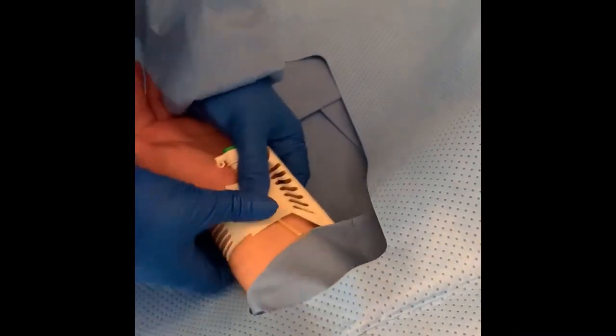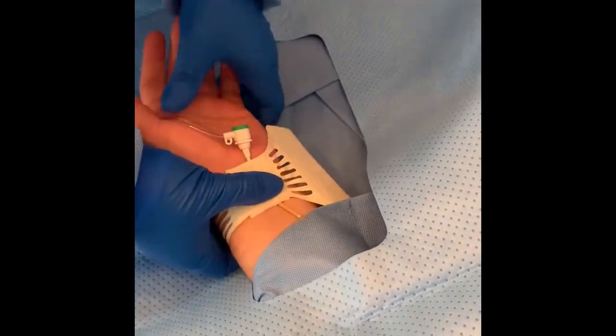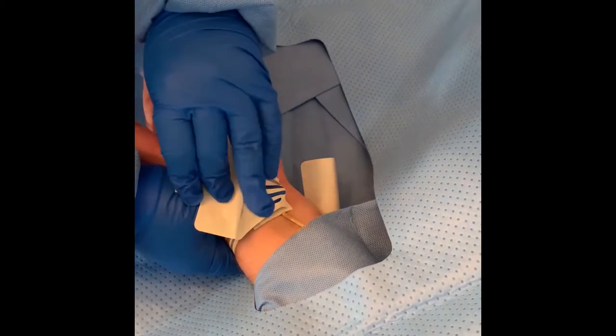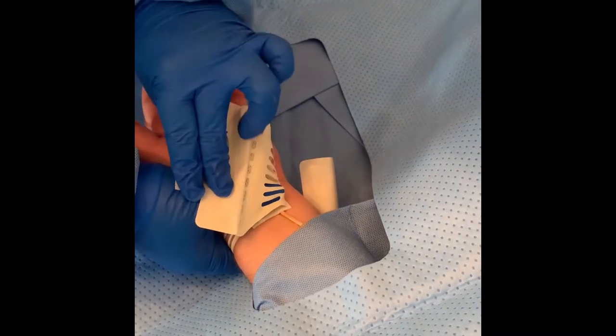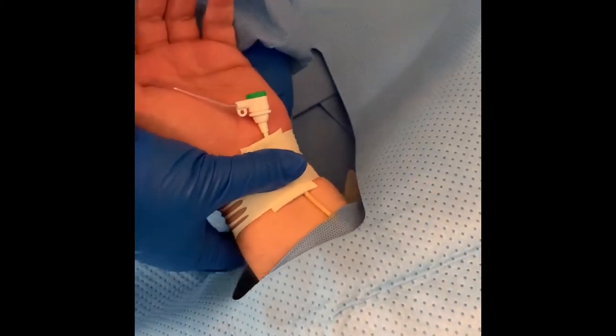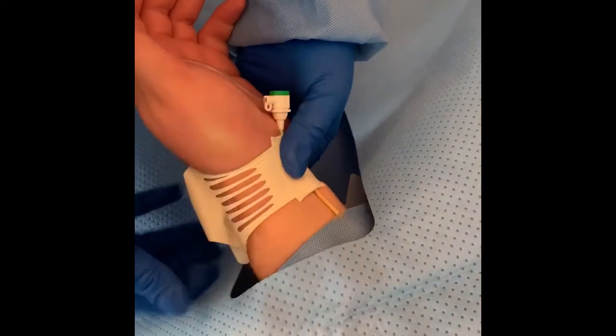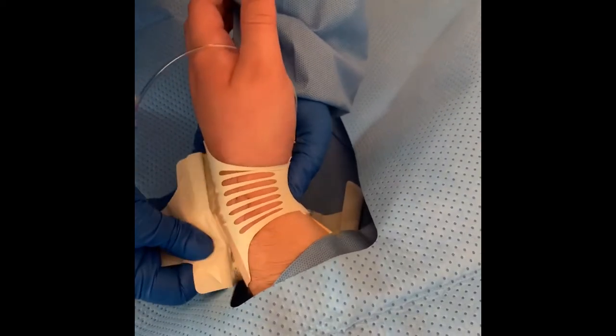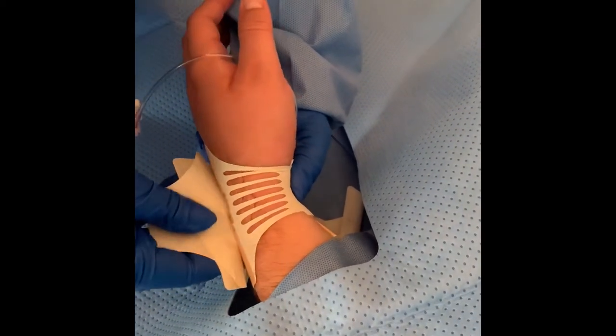Switch hands and secure the center of the bandage with the opposite thumb. Use the opposite hand to peel back half of the protective sheet on the white side, so as not to get the adhesive stuck to your gloves. While still holding the thumb in the middle of the bandage over the puncture site, take the white side of the dressing, stretching it so that you can wrap it around to the middle of the back of the wrist, effectively securing it over the tan side of the bandage, which is already secured to the patient.